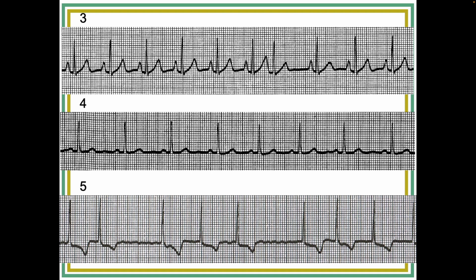I'm just keeping you honest, putting a few sinus rhythms in with atrial. Okay, let's do one more, and then we'll call it a day. Chris? So for 5, this is irregular.